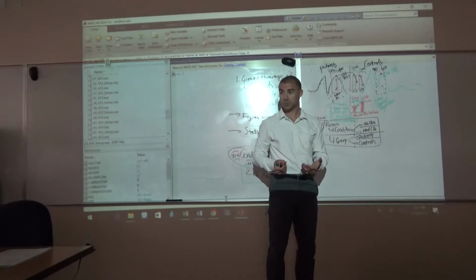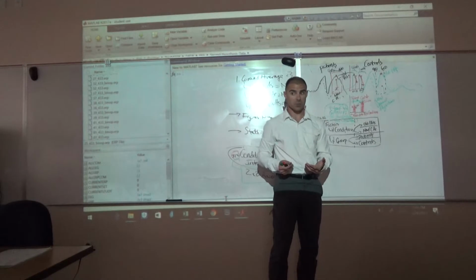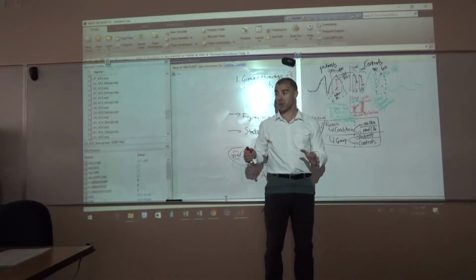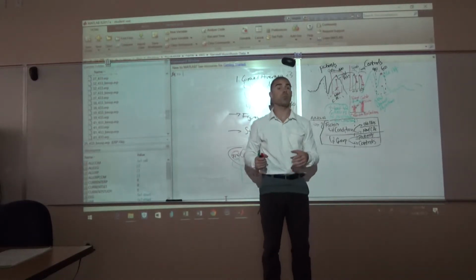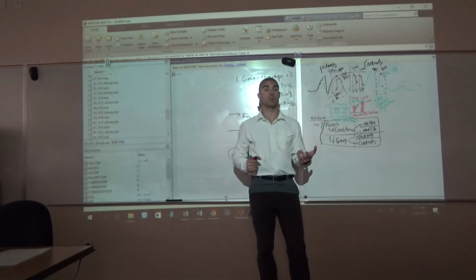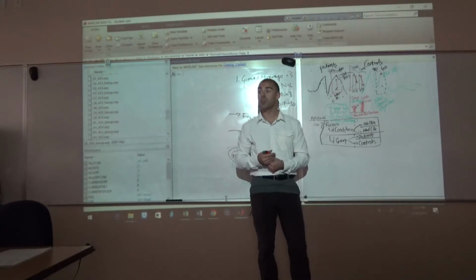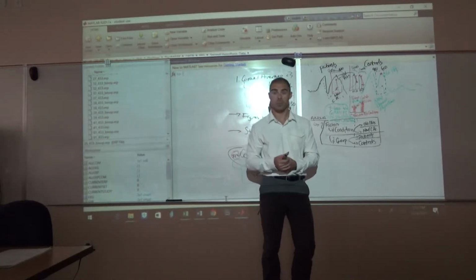All right? You gonna want me to say it again? He's got it? Okay, so we've been doing a type 1 t-test for one group. We are now going to do a type 2 t-test because it allows us to do the same thing as an ANOVA, but instead with a little bit more simplicity. Okay? It's the computational equivalent.